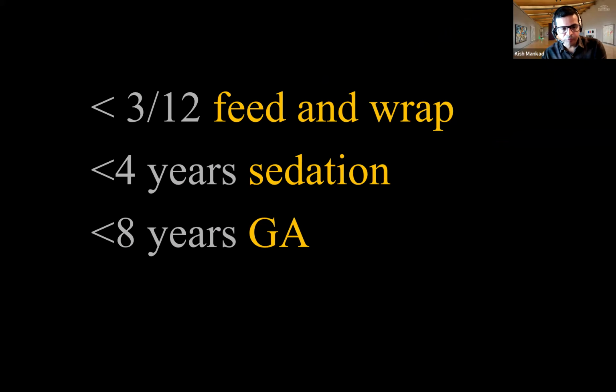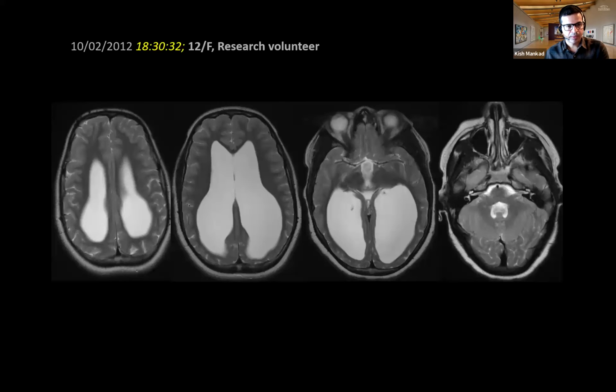There is a lot of move, and it's correct that acute imaging should be moving to MR systems, because it gives you a lot more information about the timing, particularly in stroke or in acute tumor-like presentations, and the miss rate on a CT scan, even of subtle hemorrhage, can be quite high, particularly when you have not managed to do a CT scan within an allocated 6-hour period, for instance.